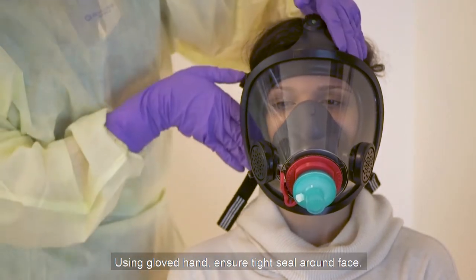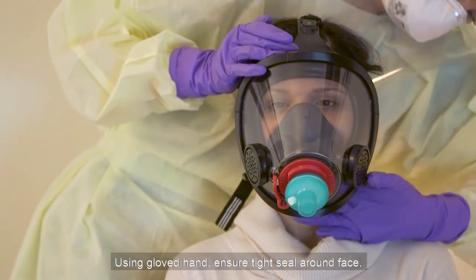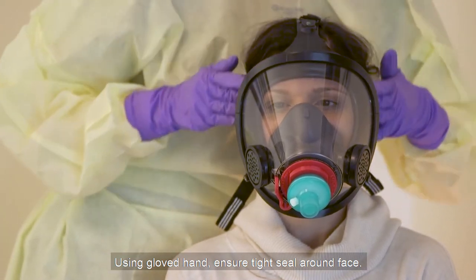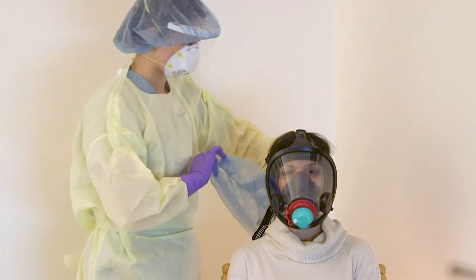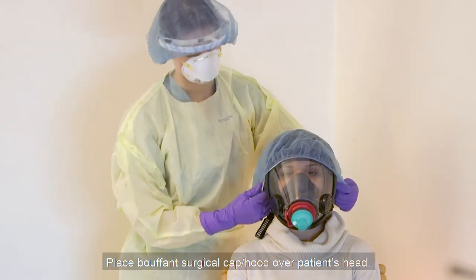Using a gloved hand, ensure a tight seal around the face. Place the bouffant surgical cap hood over the patient's head.